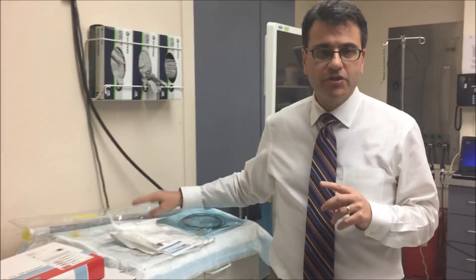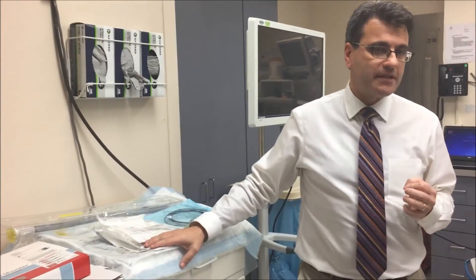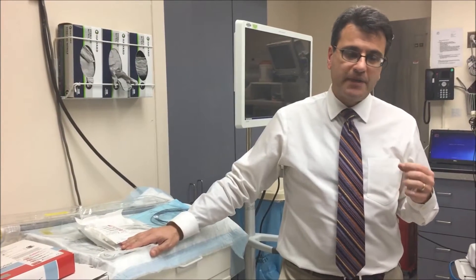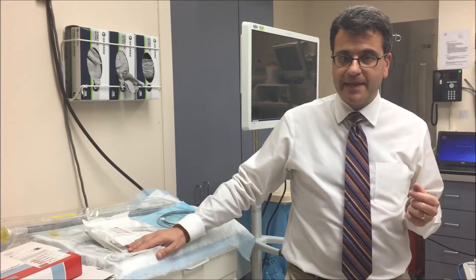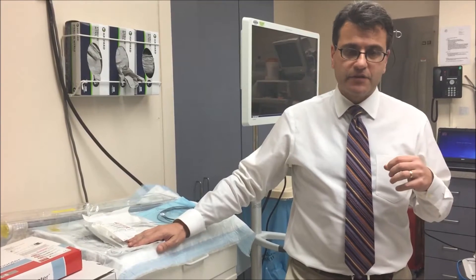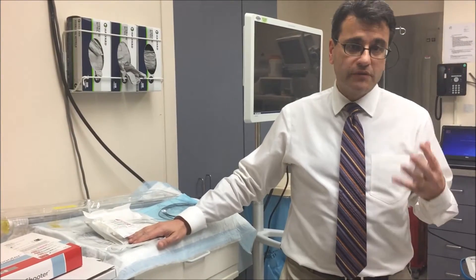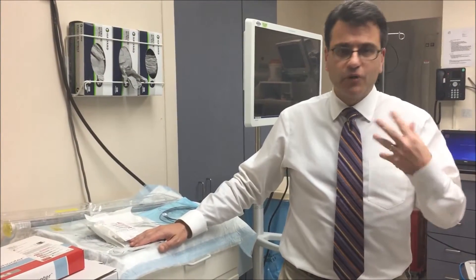There are really two types of emergencies that we deal with here at the hospital. The two would be foreign bodies or food impactions, and the other of course are GI bleeds. So I'm going to start with going over the equipment that we need to remove foreign bodies or bones that people might swallow or whatever else.